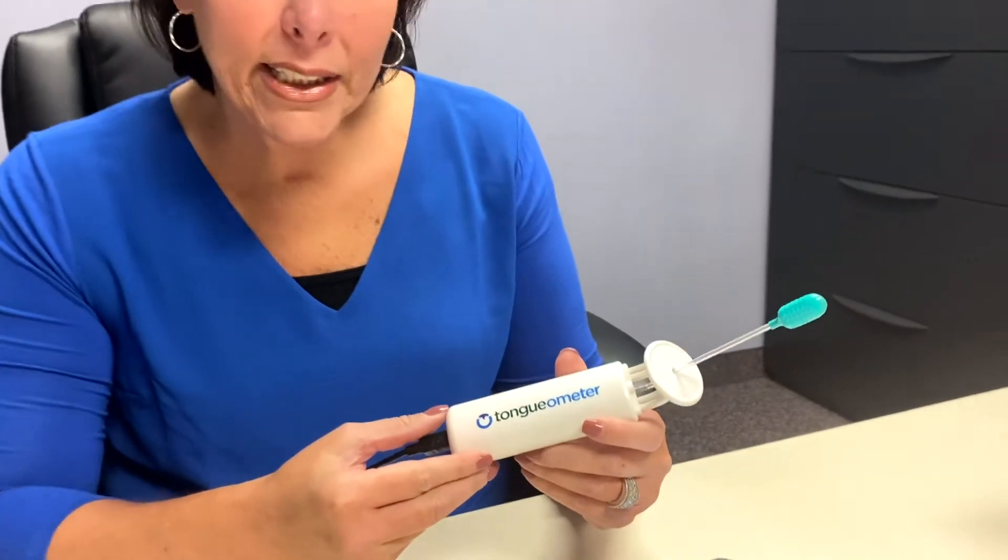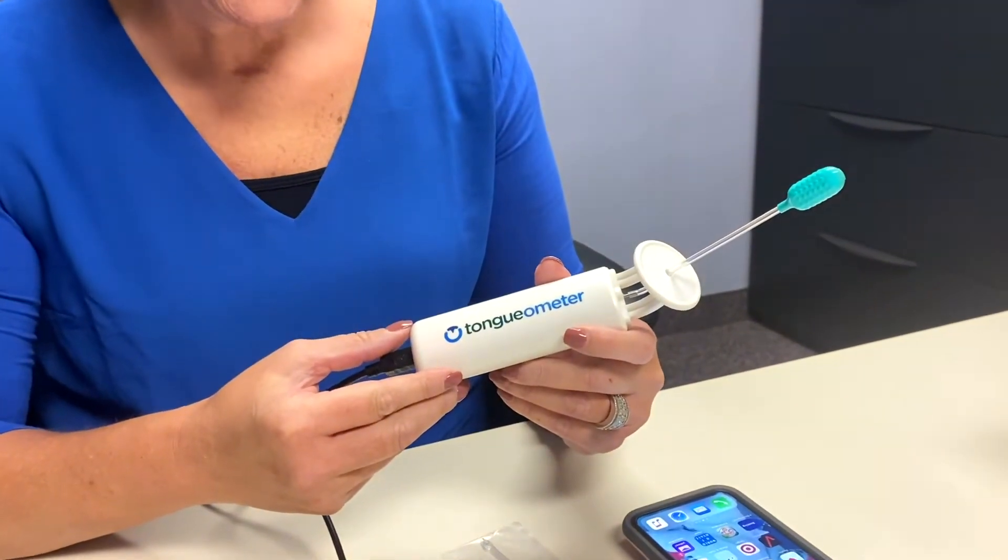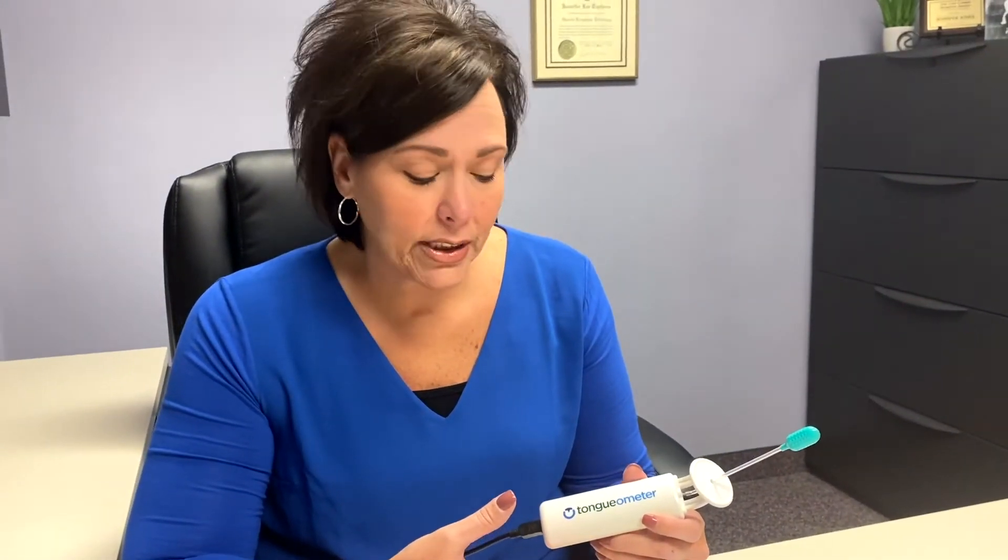Hello, I'm Jennifer Jones, Director of Therapy Services at Gateway in Florence. Today I'm going to talk with you about the Tongometer, which is a device that we've recently acquired here at Gateway. I'm also a speech therapist, so I wanted to demonstrate the Tongometer and talk a little bit about what it actually does.